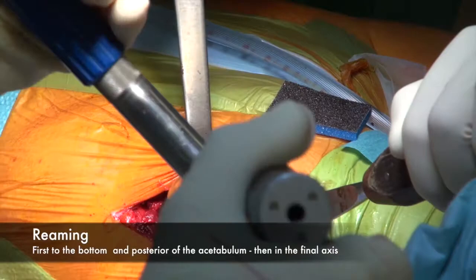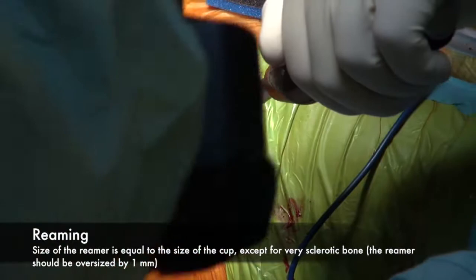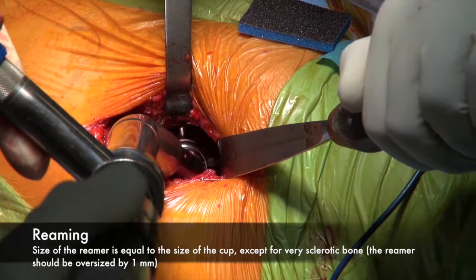Reaming. First to the bottom and posterior of the acetabulum, then in the final axis. Size of the reamer is equal to the size of the cup, except for very sclerotic bone. The reamer should be oversized by 1 mm.